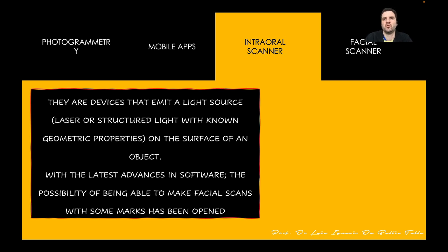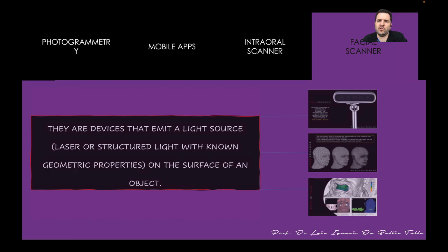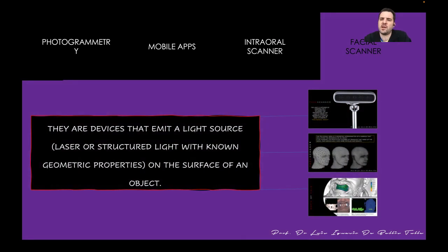But before showing you the other way, I have to tell you that you can also make your facial scans with your intraoral scanner. It's going to take you a lot of time. You have to put markers on the face of the patient so that you can get a good scan. But believe me, it's not going to be the best way to do this. So we're going to move into facial scanners.